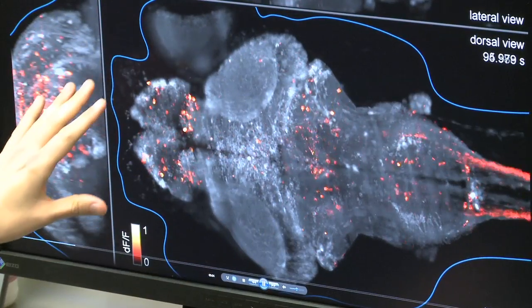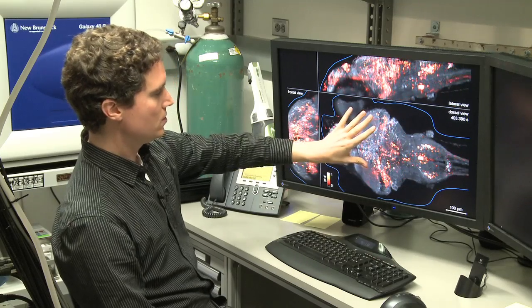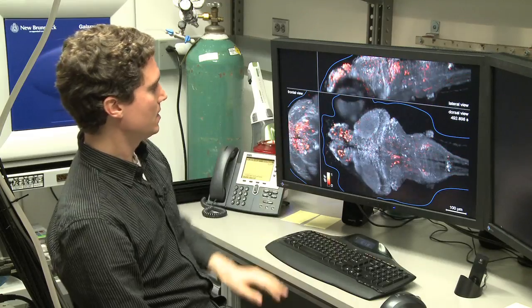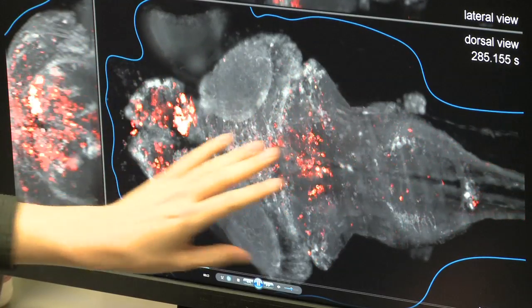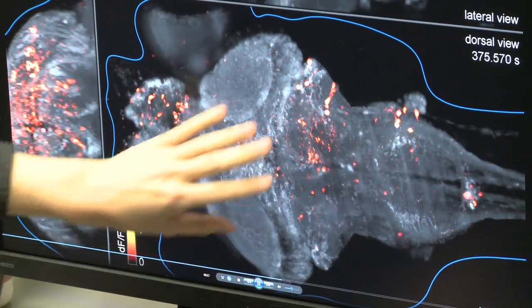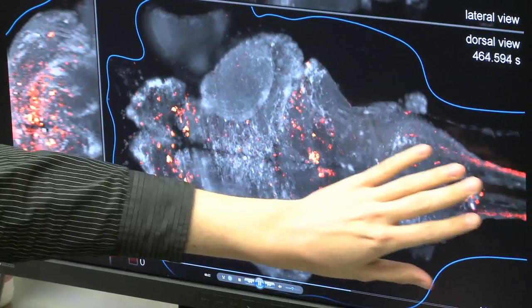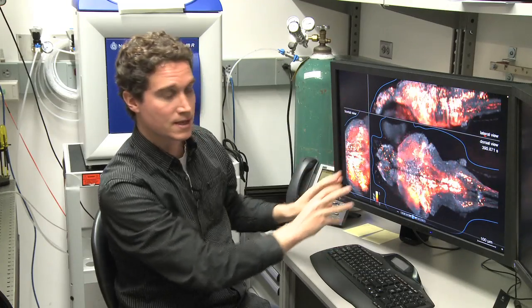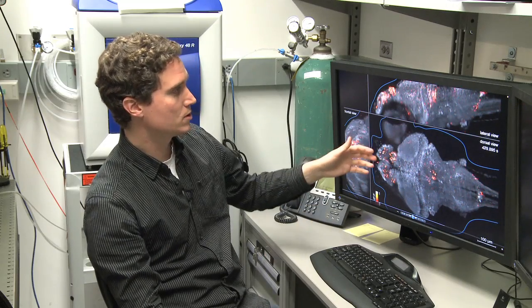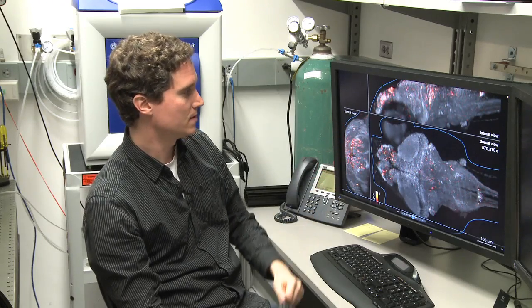So you can basically see the entire brain from three different perspectives. This is the top view, this is the view from the front, and this is the view from the side. You can see the different brain areas, the forebrain here in the top. This is the optic tectum, the hindbrain, all the way down to the spinal cord over here. So the red flashes that come up from time to time, particularly this big one just now, show the neuronal activity that we record in this fast imaging experiment.